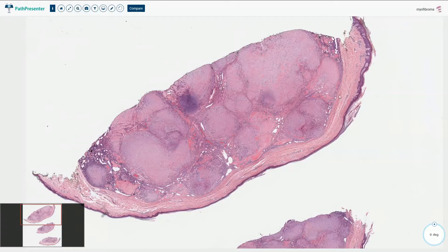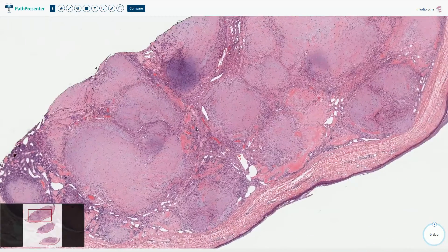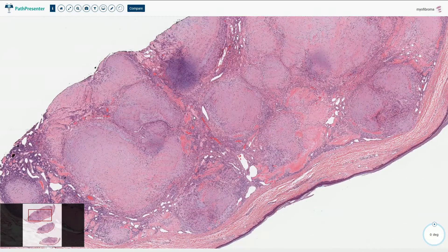It is a well-circumscribed lesion which has two components. Here we have the nodules or lobules composed of myoid cells — that's the first component. In between these lobules we see a more cellular component which resembles solitary fibrous tumor, previously called hemangiopericytoma — and that's the second component.